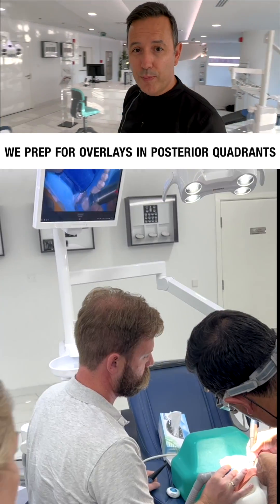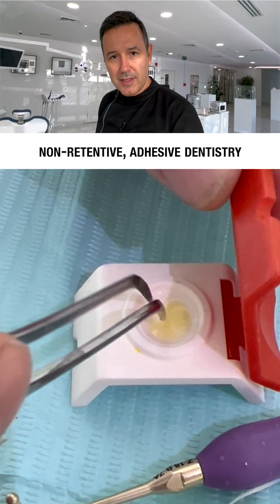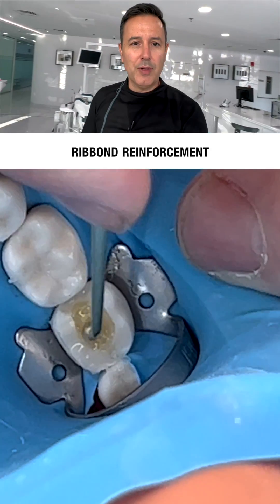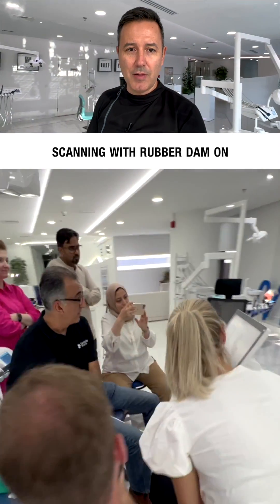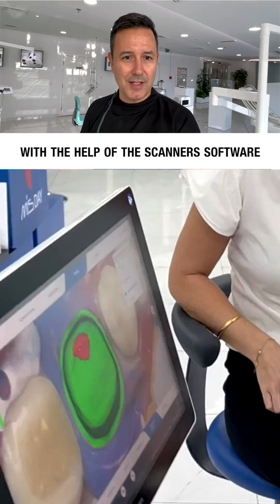On the second day, we prep for overlays in posterior quadrants. Minimally invasive, non-retentive, adhesive dentistry, of course. Prep with rubber dam and all the good stuff: immediate dentin sealing, rebound reinforcement, deep margin elevation, scanning with rubber dam on, and managing the restorative space with the help of the scanner's software.